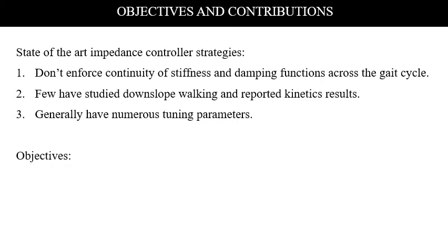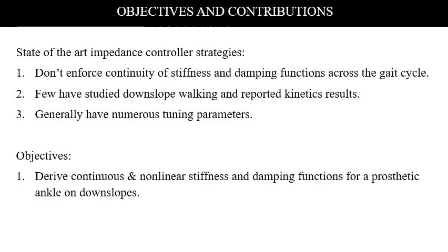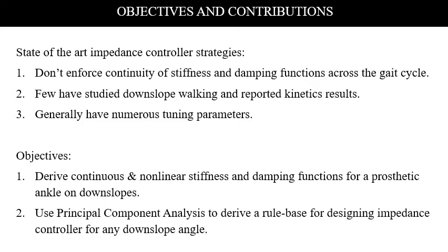Now, our objectives were to derive continuous nonlinear stiffness and damping functions for a prosthetic ankle on downslopes, and use principal component analysis to simplify these functions and derive a rule base for designing impedance controllers for any downslope angle.